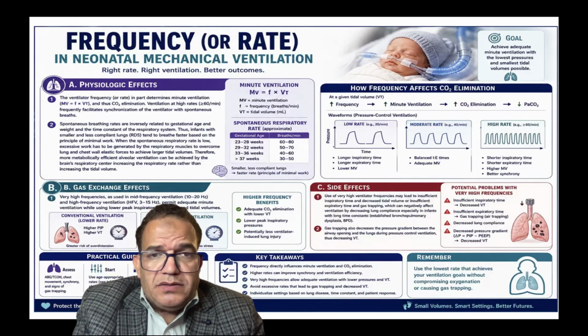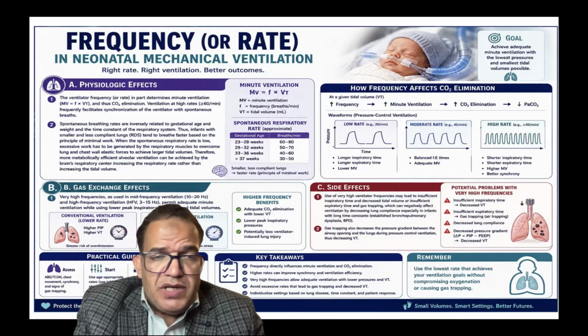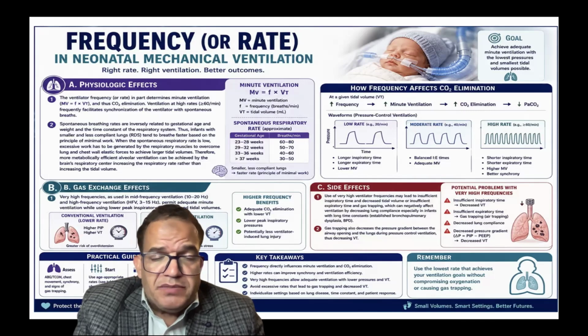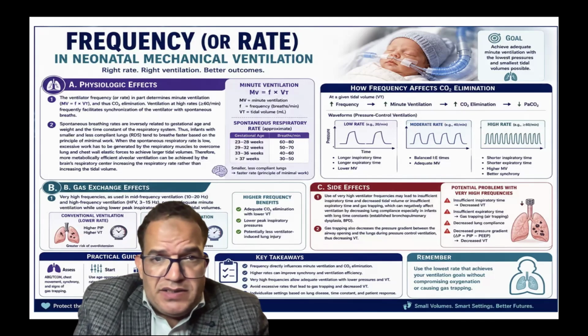What will minute ventilation do? The frequency is linked to the minute ventilation. Minute ventilation will improve CO2 elimination and decrease the partial pressure of CO2. I didn't talk here about oxygenation. Most of the role of frequency is just to try to control the CO2.